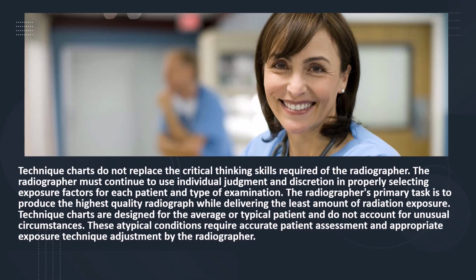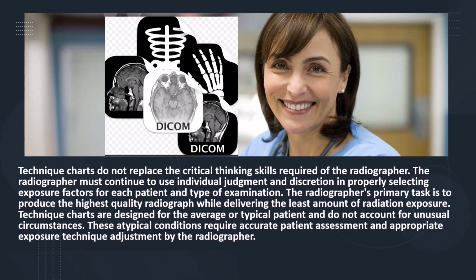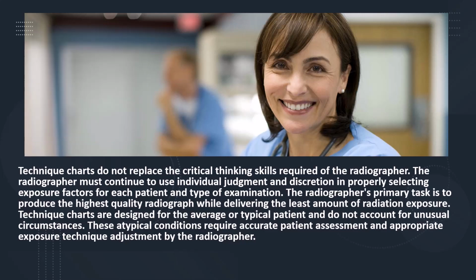Technique charts do not replace the critical thinking skills required of the radiographer. The radiographer must continue to use individual judgment and discretion in properly selecting exposure factors for each patient and type of examination. The radiographer's primary task is to produce high-quality radiographs while delivering the least amount of radiation exposure. Technique charts are designed for the average or typical patient and do not account for unusual circumstances. These atypical conditions require accurate patient assessment and appropriate exposure adjustment by the radiographer.